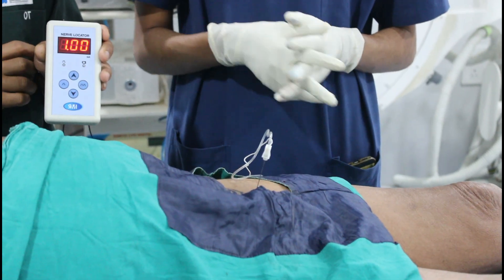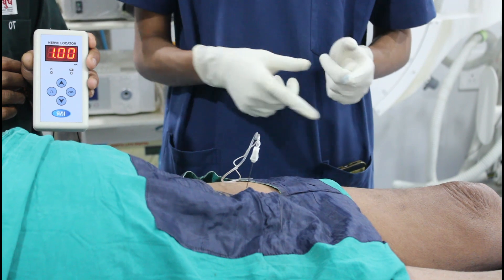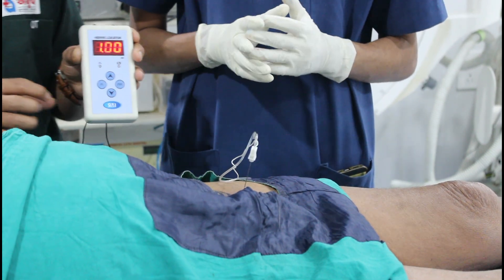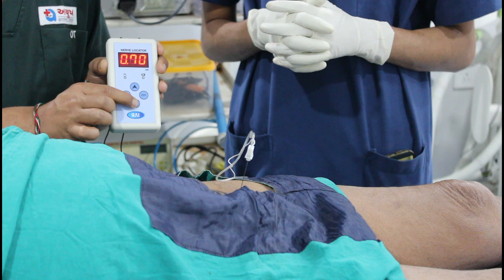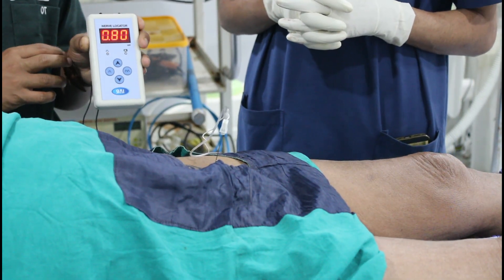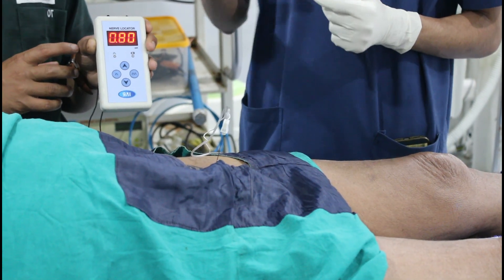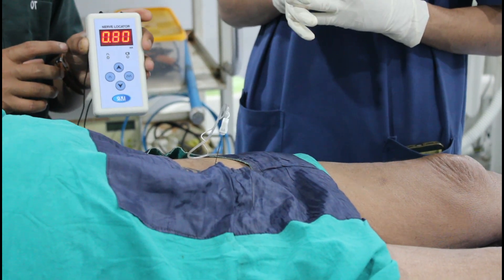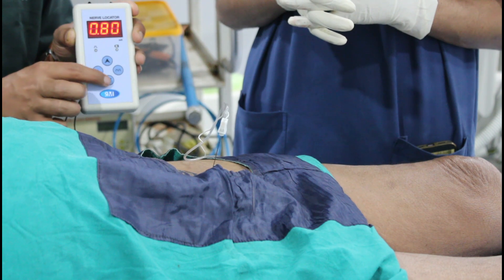At 1mA current also I am nicely getting the adductor longus contraction. Now go to 0.8mA current. At 0.8mA current also I am nicely getting the contraction. Now go to 0.5mA current.